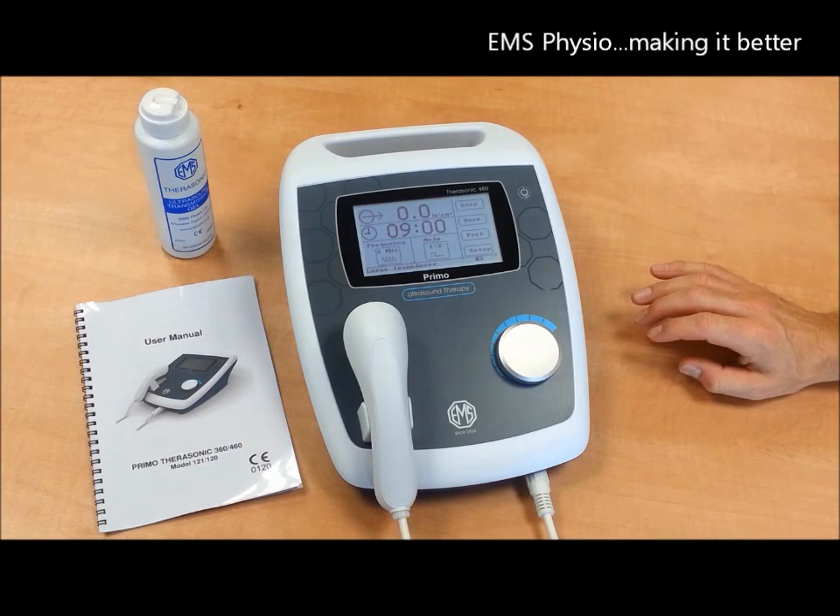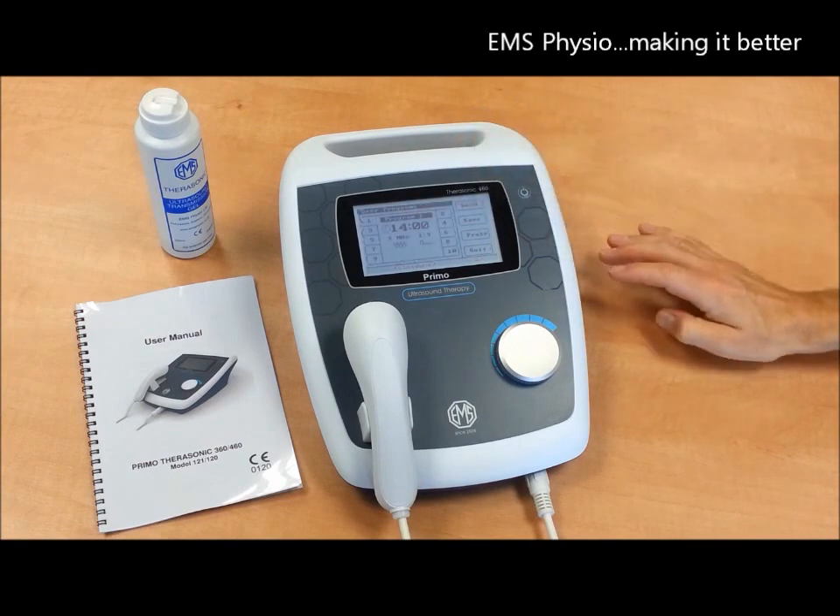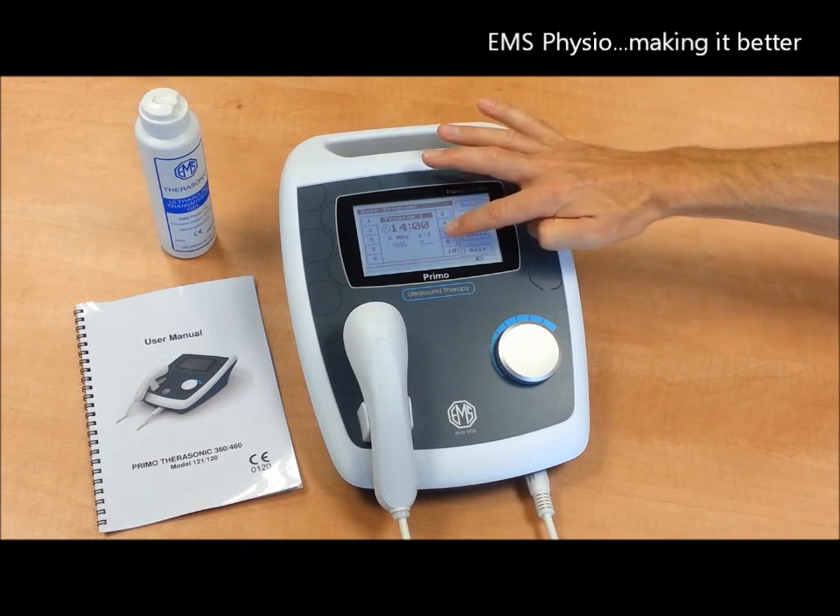If you have a number of preferred settings you wish to save, the Therasonic 460 allows you to save up to 10 different settings of your own choice for easy access when you need them.